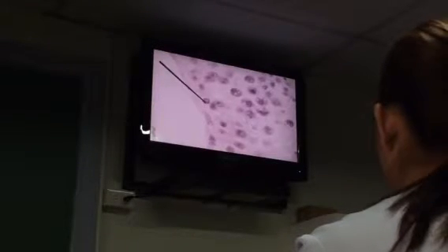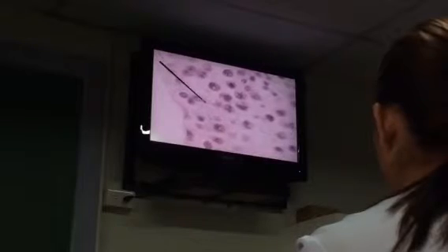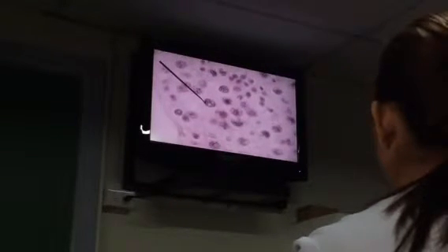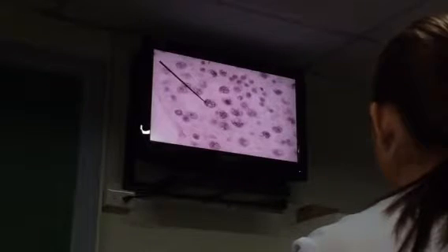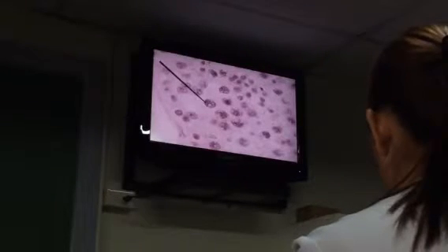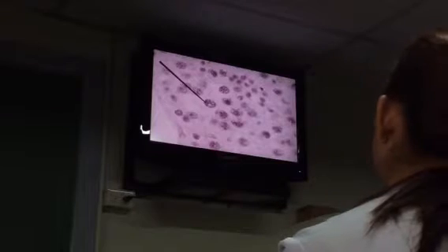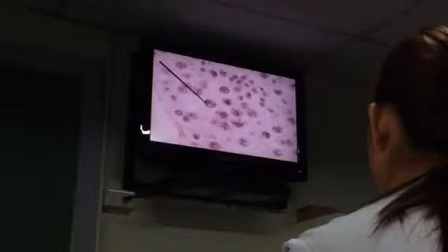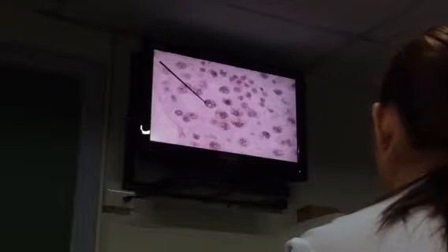Again, we'll see the next stage, which is the biggest cell. You can easily see here your genetic material scattered, diba? Within the nucleus. This is now the largest cell. This is now your spermatocyte, specifically the primary spermatocyte. Again, we do not see the secondary form because they rapidly change to the next stage, which is the spermatid.